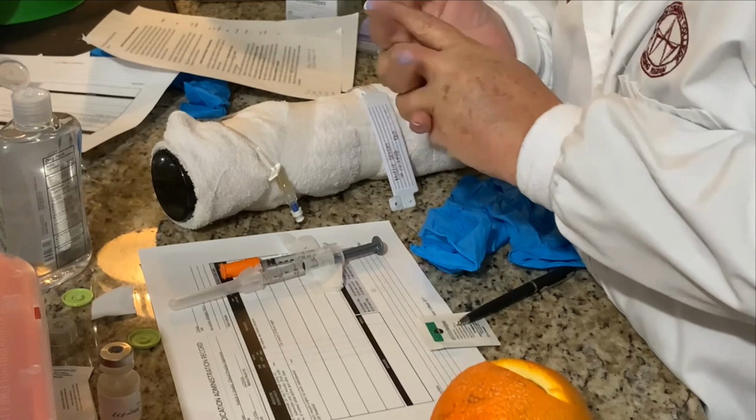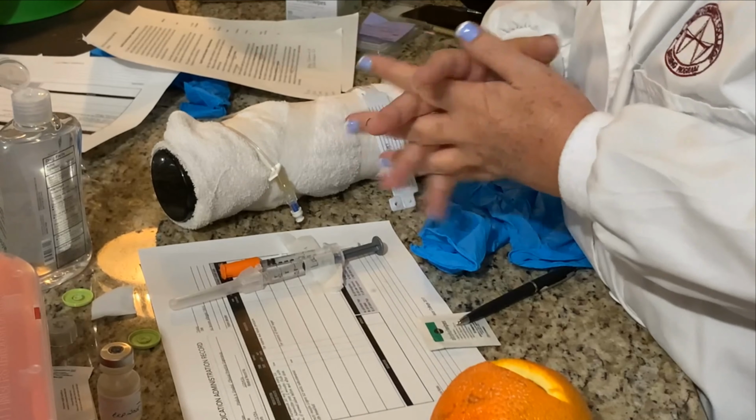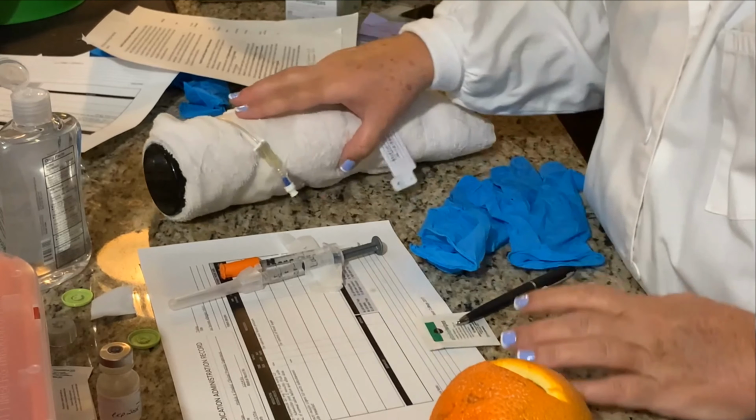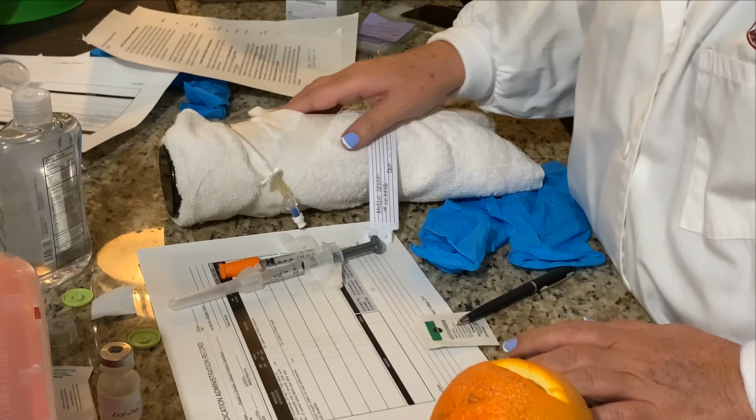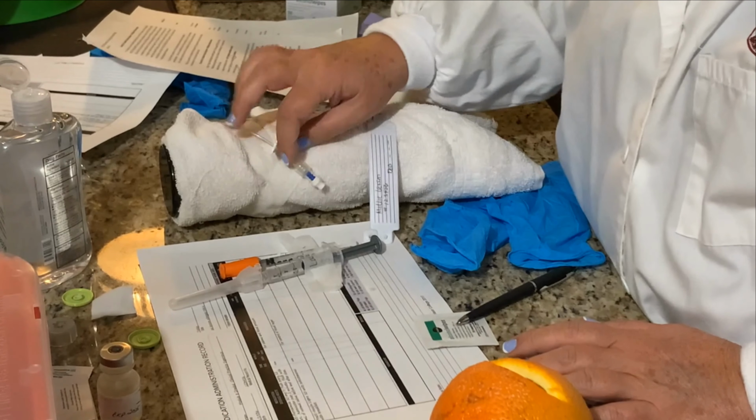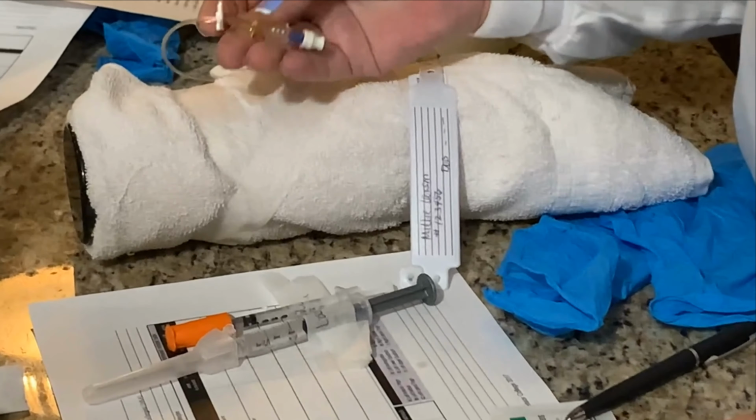And I'll say, Millie, I'm going to be giving you some furosemide. This is for your heart failure. And it just helps get some of the extra fluid off. I'll be giving that to you in your IV. And I'm looking at her IV to make sure there's no redness, no edema, no swelling. And of course, your IV should already be clamped here at this clamp.